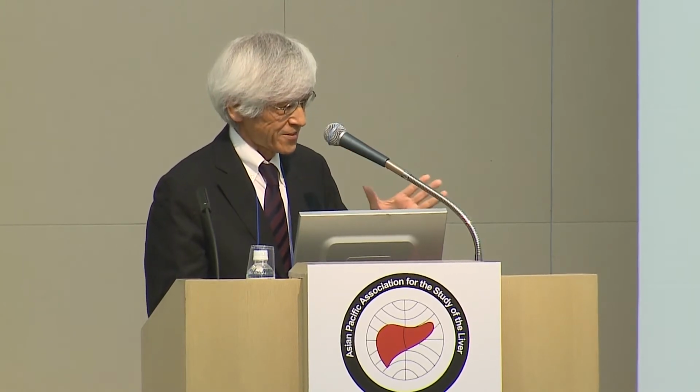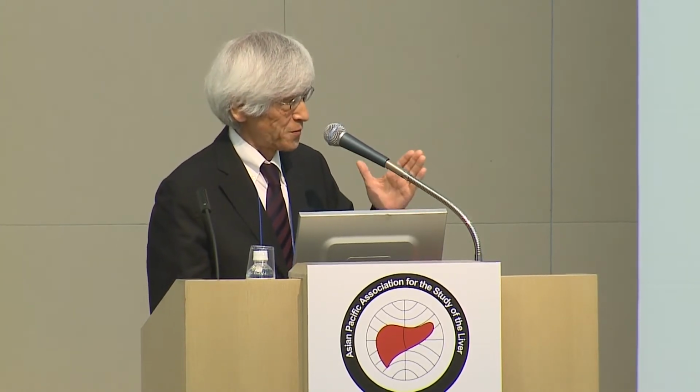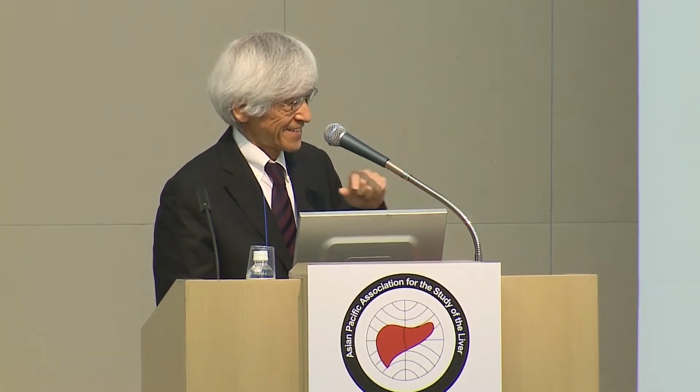Yeah. For exact identification of the drainage area, we need angiography-assisted CT. But as I told in my lecture, maybe we can see faint enhancement surrounding the tumor in the early dynamic phase or arterial phase or portal phase. But it's not so reliable. It's a problem.